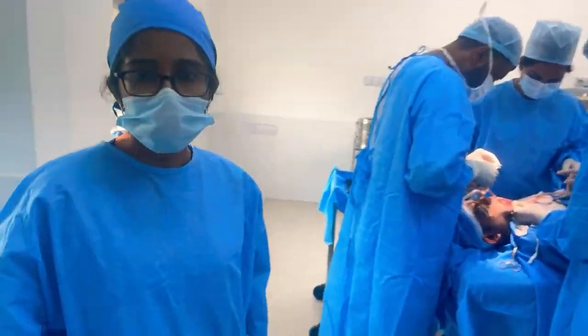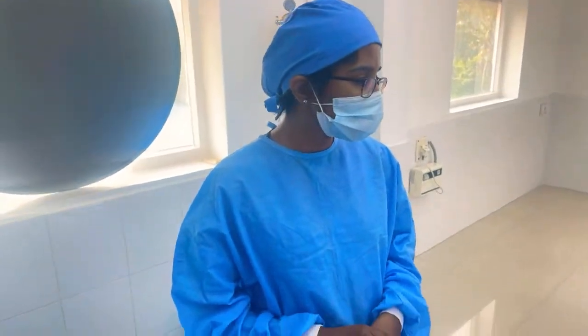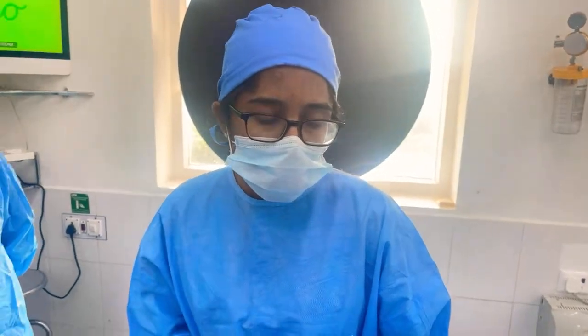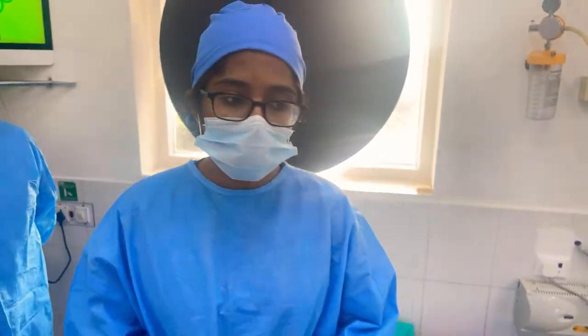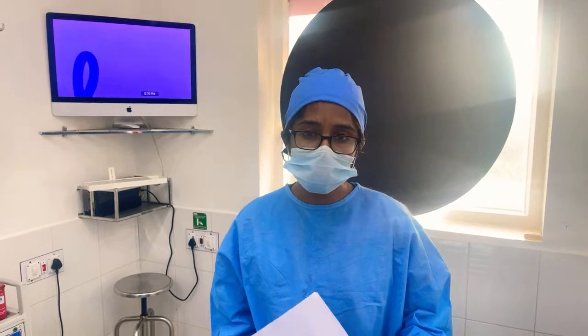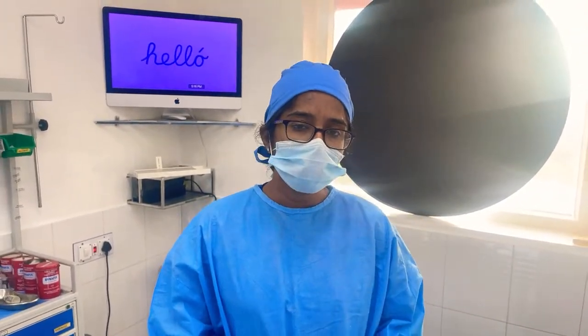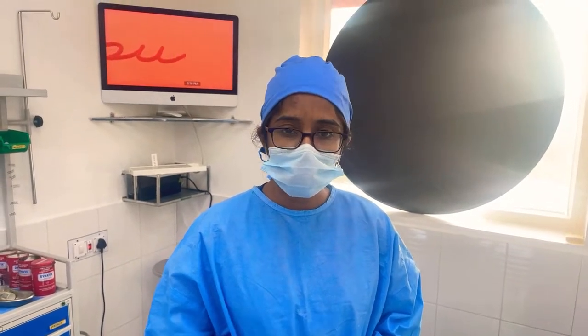So as you see, one plate has been fixed. Moving on to the second plate, two plates suffice. Both the mental nerves are intact, which means, although the mental nerves tend to stretch after the surgery, patients do experience some amount of numbness, or what we call paresthesia, but that is transient, it's temporary. It recovers within, say, a maximum of a month or maybe even a few days.